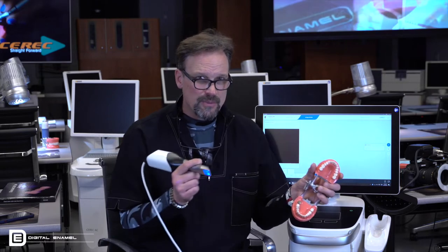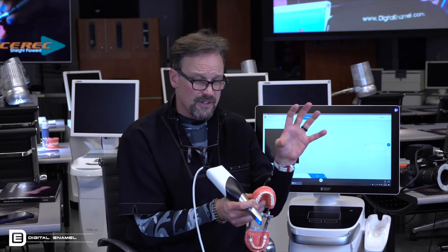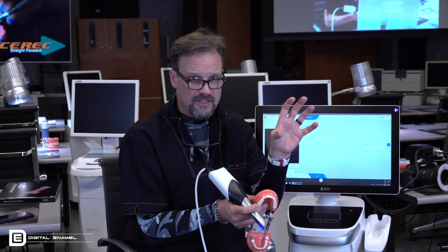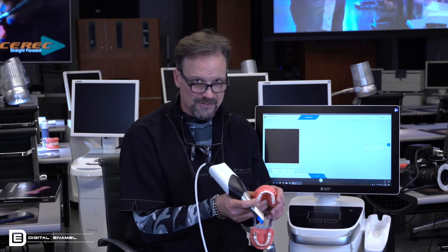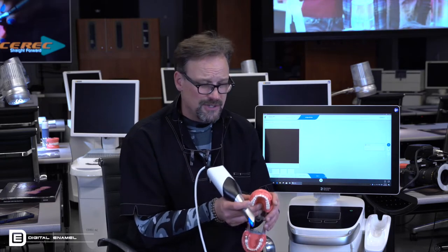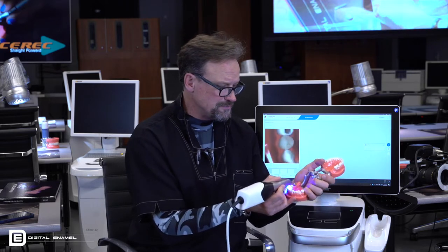Don't start in the back and then get going, because you gotta go past all of those teeth, and you may be scanning already, and then it picks up something and there'll be one little blurb of a model in there, and it can't find it ever again, and you get hung up trying to get back to that spot. So again, my personal recommendation is don't use the button. If you're a longtime user of CEREC and you like the button, use the button. But new users, try not to use the button, just let it be on. Okay, so I'm gonna start scanning the lower premolars.